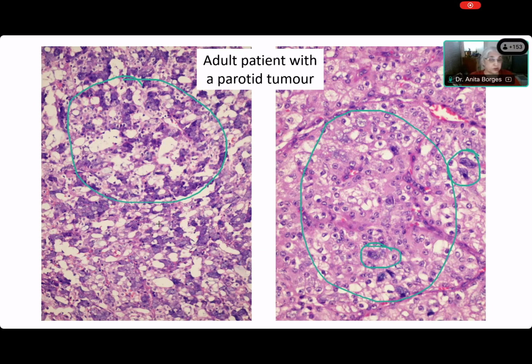So where have you ever seen basophilic and granular cytoplasm? Anybody? Serous acini can show basophilic cytoplasm. Serous acini. Excellent. So the moment you see basophilic granular cytoplasm, and yes, some clear cells, and some are eosinophilic, but even the eosinophilic cells are granular, what should come to mind? Acinic cell, yes. So this is an acinic cell tumor.